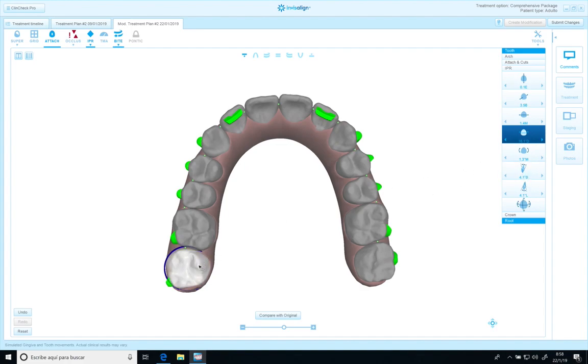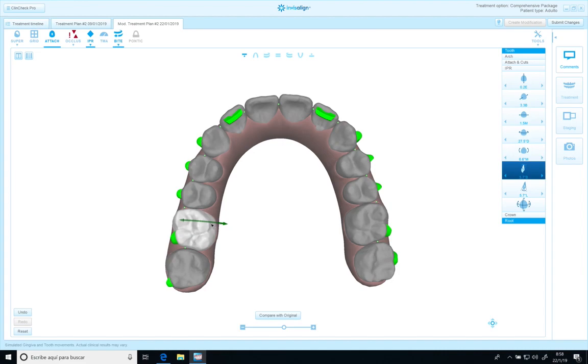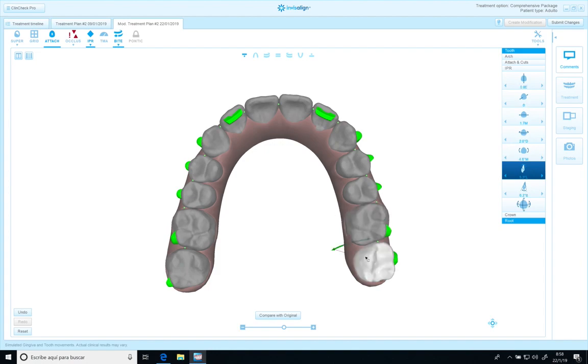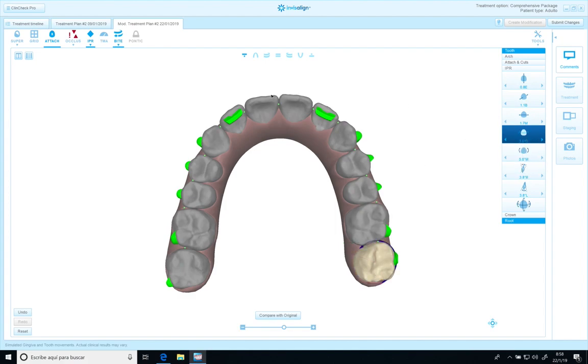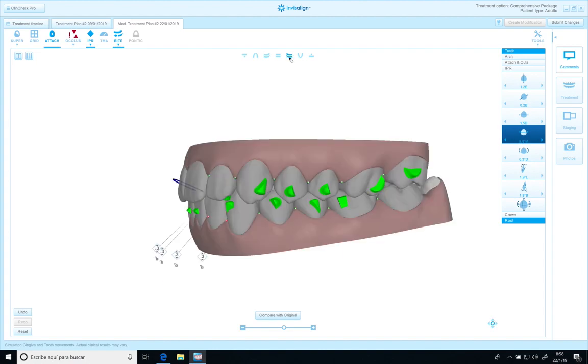Also, I'm going to increase the buccal root torque, which is so important. Because if you don't increase that when you do expansion, you have the risk of inclination of the crown and create what we call the lateral open bite.